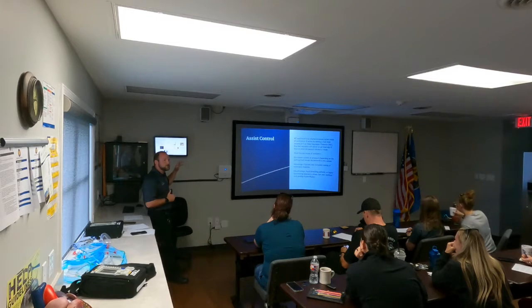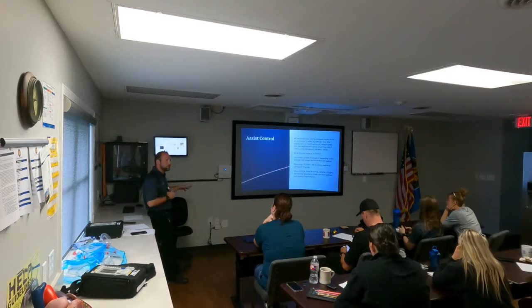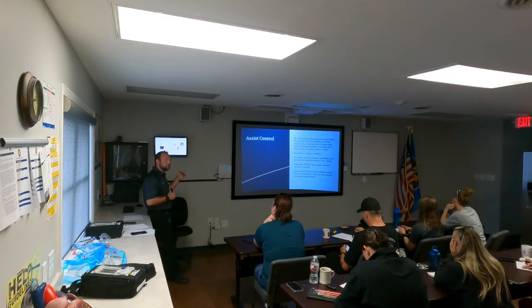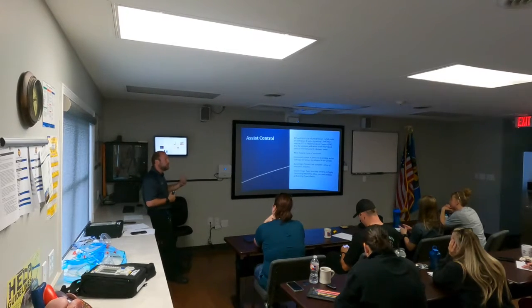AC mode is going to deliver what you set, at the increments you set, no matter what. So if you have a rate of 12 with a tidal volume of 500, every 5 seconds you're going to get a breath of 500. If the patient initiates a breath, as if they have spontaneous breathing, regardless of how well they're doing, they're going to get 500 on top of that.